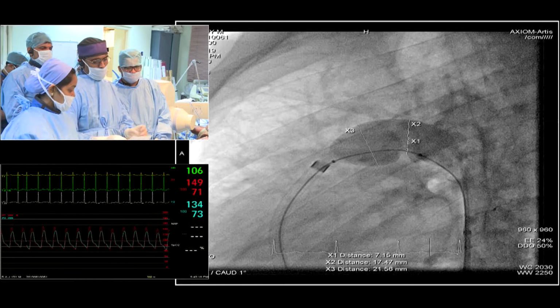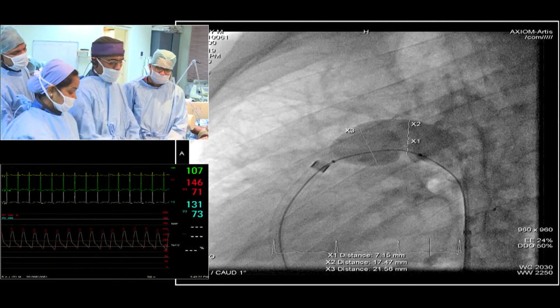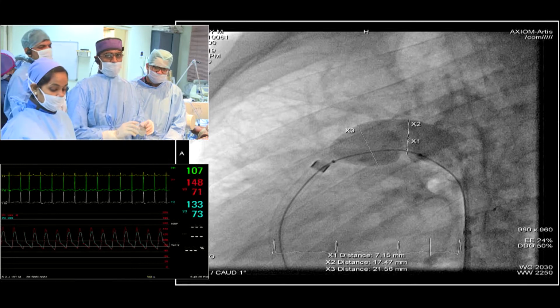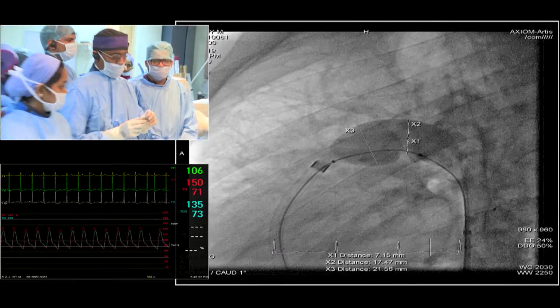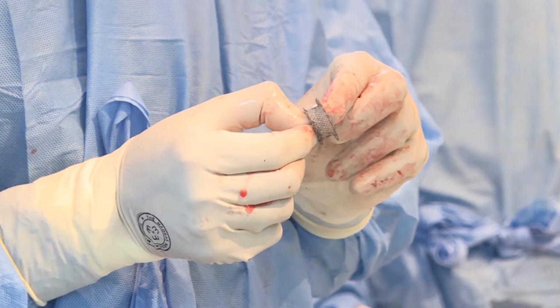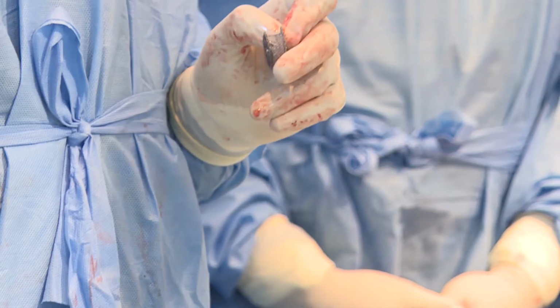Okay. If you don't have access to a 22 post-infarct VSD device, I wanted to show one particular type of VSD device that Lepu Medical makes, called the MemoPart VSD device. Can you show the picture? I suppose an alternative would be to use an ASD device or something similar. What device is that? This is a Memo. Can you show the box?